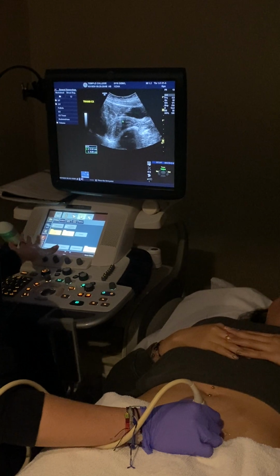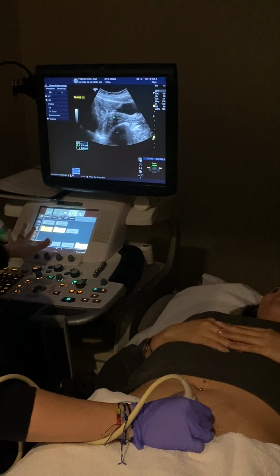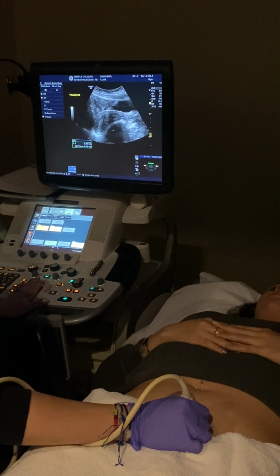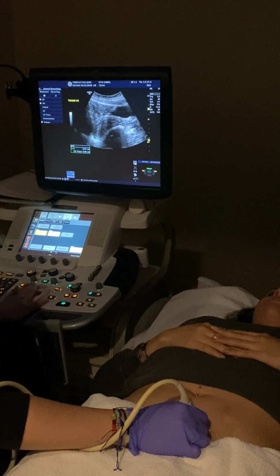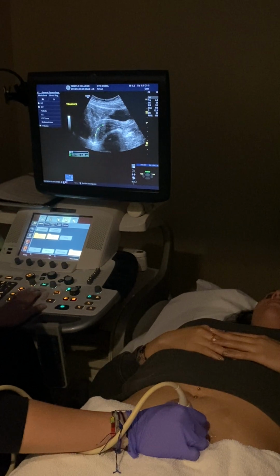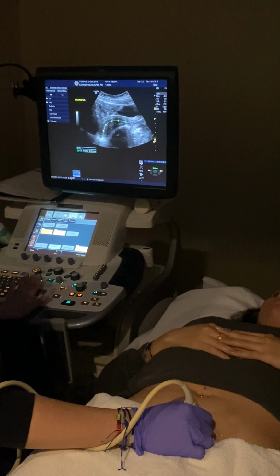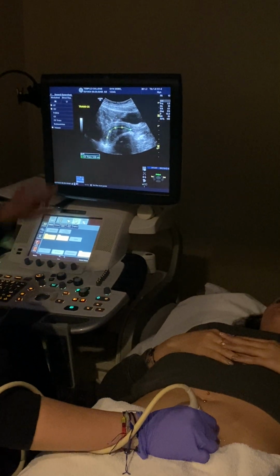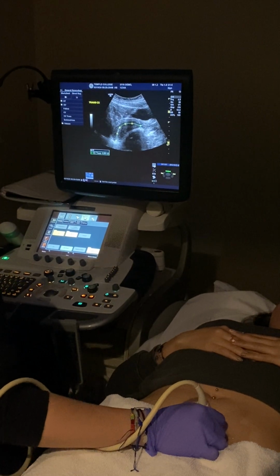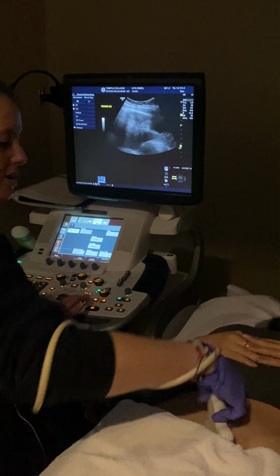So I'm gonna do, there's no trace on here. Okay, I'm gonna use the cervix trace. Never mind the fact that it says cervix, but I want you to see how you measure it when it's like that. So we'll go all the way to the edge here with the fundus, and you're tracing the endometrium. Everybody see that little central canal area? It's kind of more hyperechoic than the rest of it, and out to the edge. That is the length of her uterus. Does everybody see how I got that? So what I have to do, it's not just long and trans anymore.